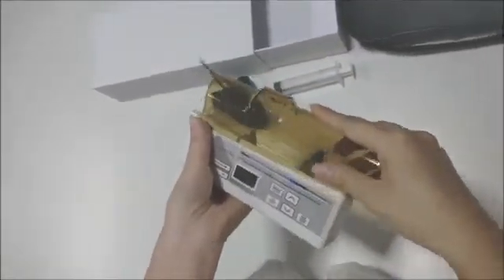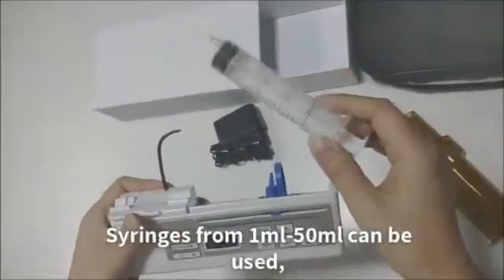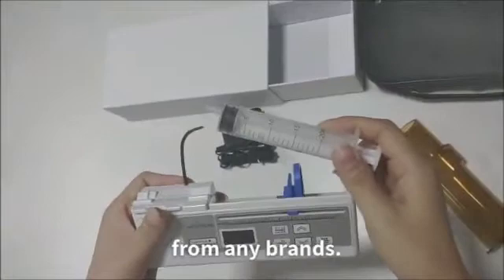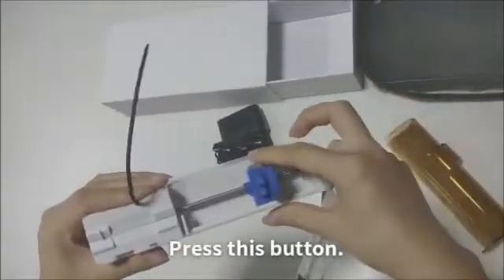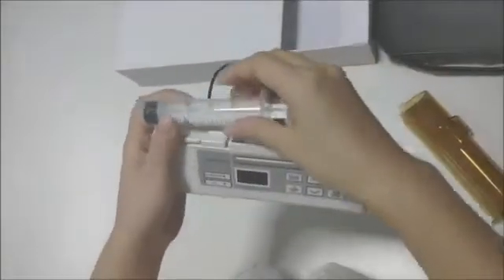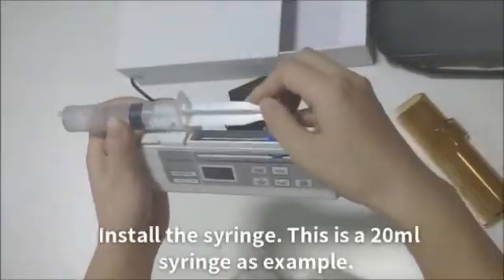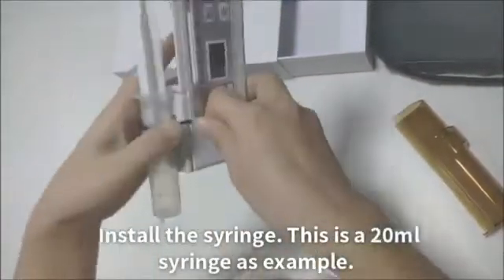Take off the cover. Install the syringe. Syringes from 1 to 50 ml can be used from any brands. Press this button — this can move flexibly. Install the syringe. This is a 20 ml syringe, as example.